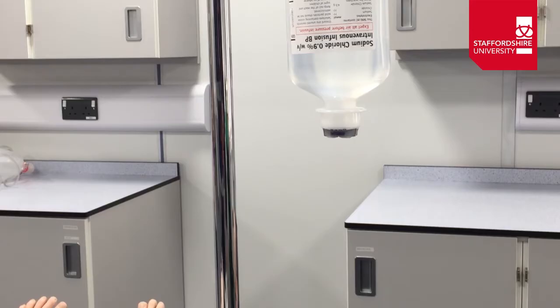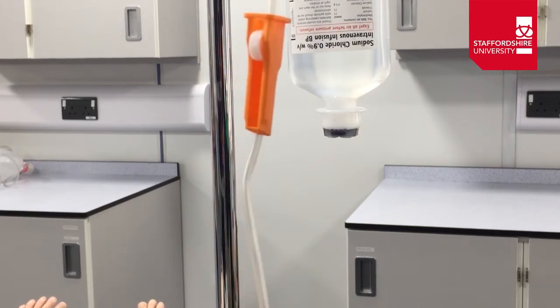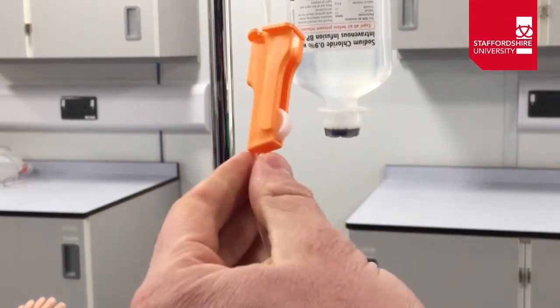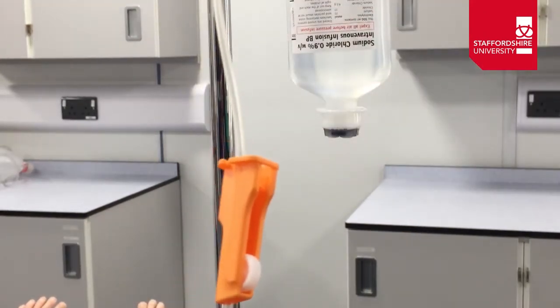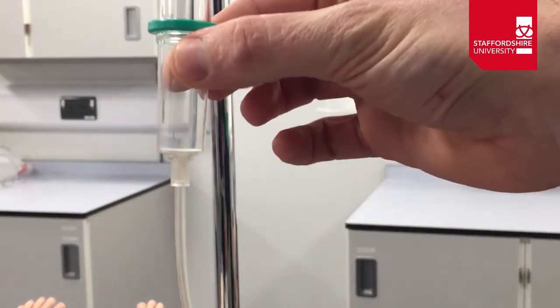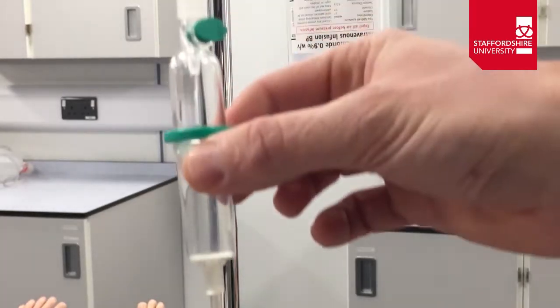We're now going to connect the giving set to the bottle of fluids and then up to the patient. First, on the giving set, check that the flow control is closed — scroll it all the way down to the closed position. Also check it's appropriately positioned, with a nice distance away from the drip chamber at the top where you'll count the drop rate.